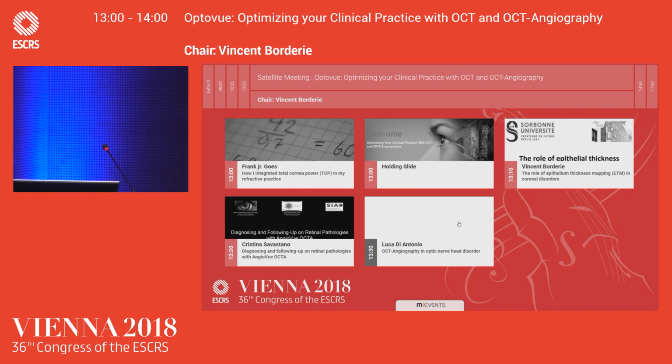In real clinical practice, we have been using OCT angiography for about four years and a half, and we have reduced fluorescein angiography study and evaluation by about 90%. We reserve fluorescein angiography just for the study of the periphery, when we have some doubt, for example, in diabetic retinopathy, when we want to evaluate the extreme periphery.